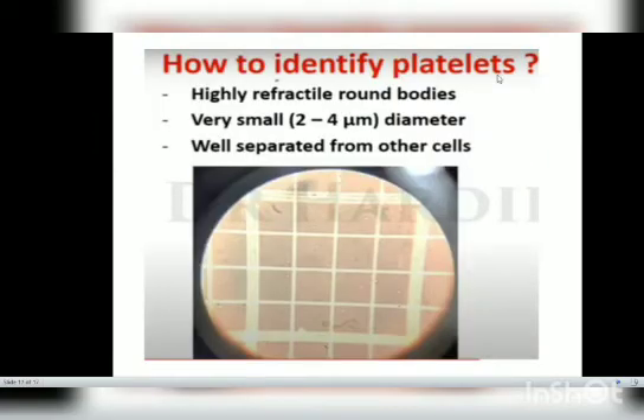To identify platelets: platelets are highly refractile, round bodies. They are very small — two to four micrometers in diameter — and are well separated from other cells. The small spots visible in the microscope image are the platelets.